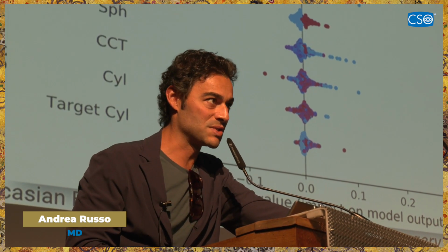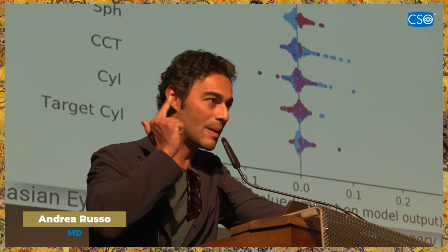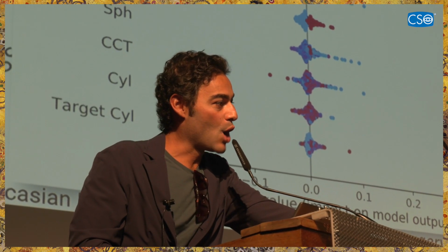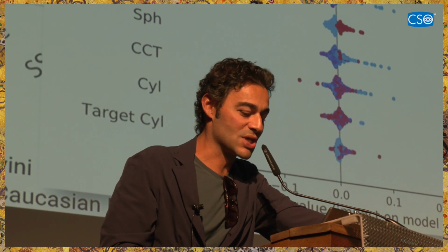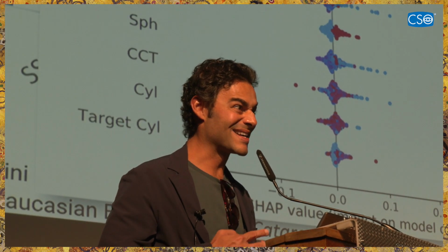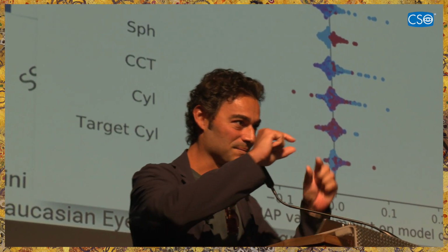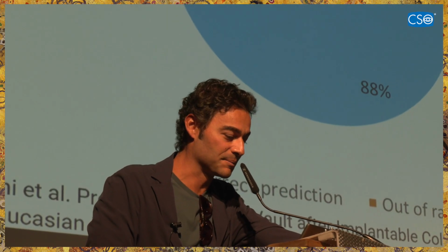So we have to take into consideration the deformability of the ICL itself and the deformability of the ciliary body. Just for your curiosity, only 20% of the lenses that we implant go into the sulcus, and the vast majority of those lenses are hyperopic ones, probably because they are stiffer, because they are thicker in the center, and so they have a lower deformability.